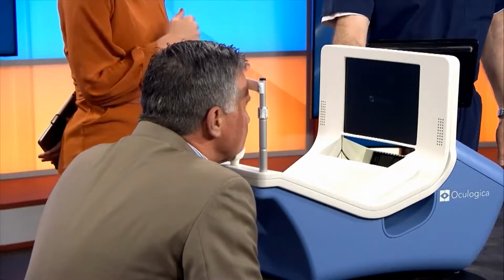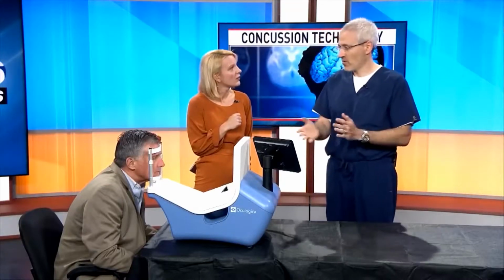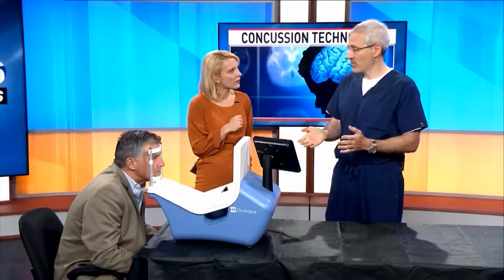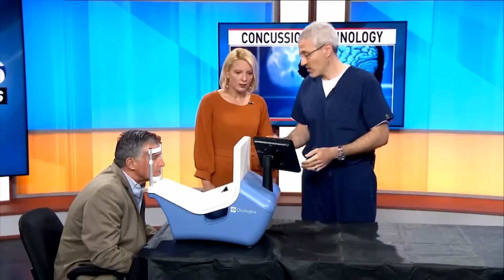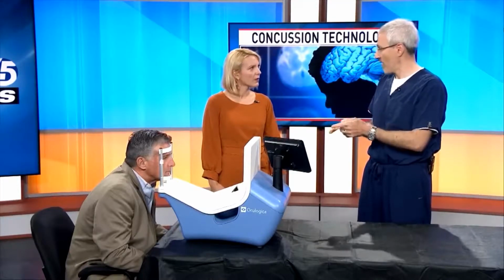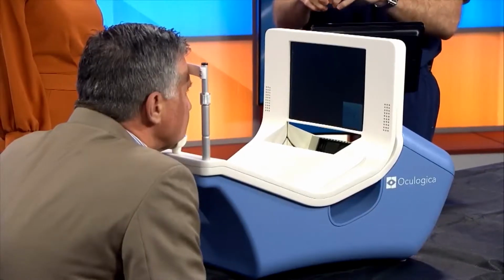How many minutes? So in under 4 minutes, about 3.5 minutes, it will tell us whether or not he's suffered a concussion. That's incredible. And it's FDA approved for 5 years old up to 65 and up to a week out from your initial head trauma. Basically what it's doing is he's watching a movie that's moving around this screen right here. And it's tracking his eye movements.